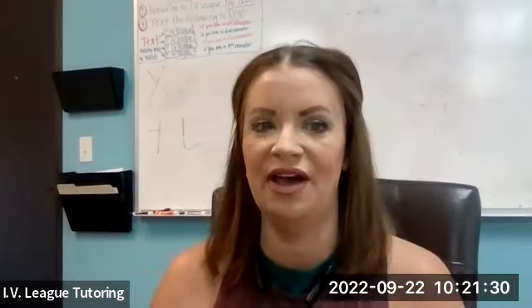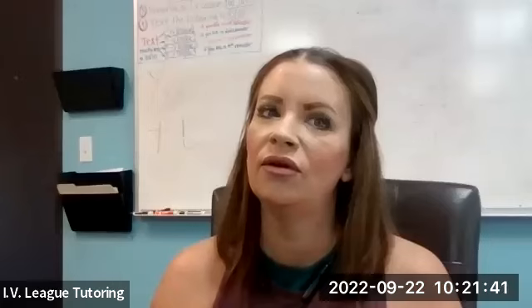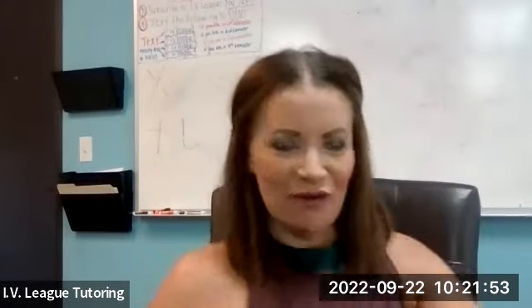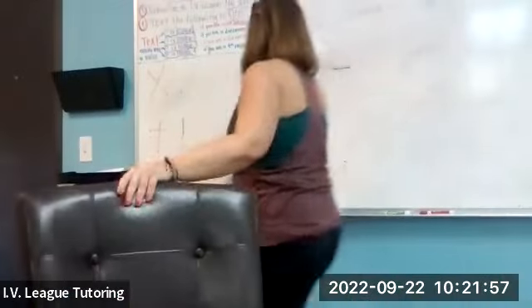Yeah. Okay. How do you calculate a heart rate when you get a 6-second strip? Multiply by 10. Multiply what by 10? The R. So the QRS complexes, right? Okay. Do y'all know how to do that? Do I need to do it for you? Do it for me. How many do you see? Do it for me. Do everything for me. Well, it kind of made sense when he did the 300.